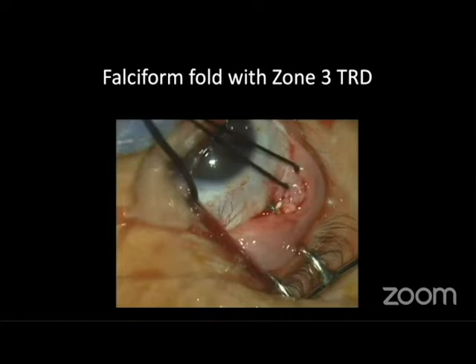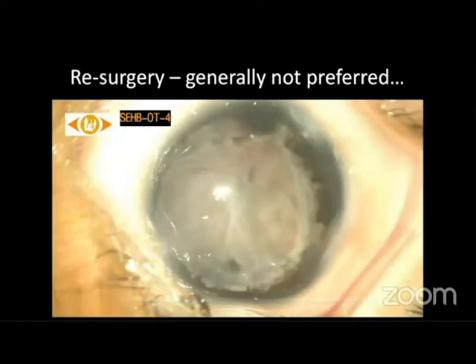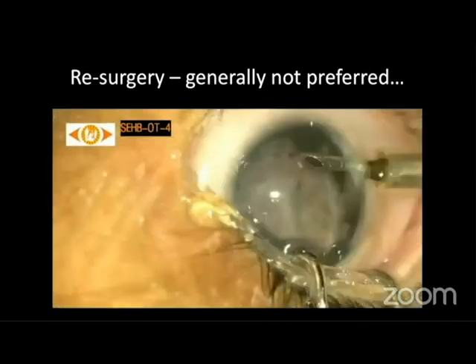Instead of removing the fibrous tissue and allowing the retina to fall back, we shorten the sclera so that the traction at the falciform fold is relieved and the retina goes back. This can be done in an extremely anterior disease, despite which there is a falciform fold extending posteriorly towards the macula. ROP resurgery is generally not preferred, and rarely do I do those.